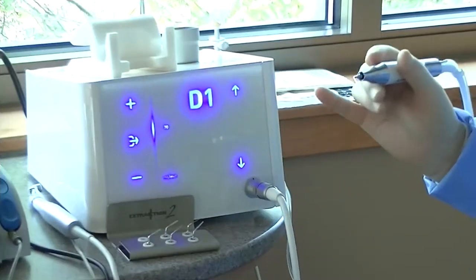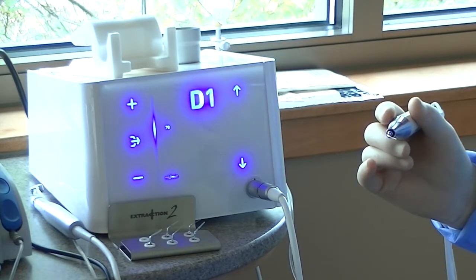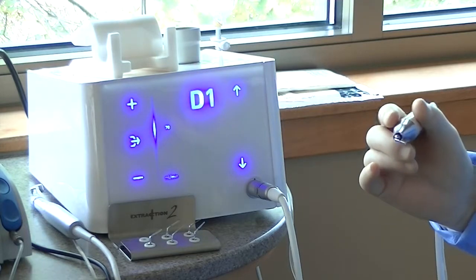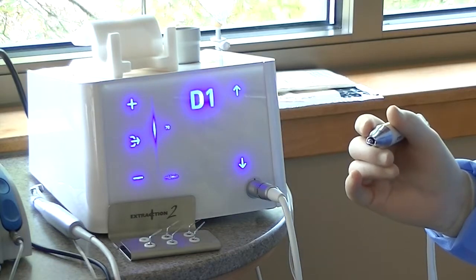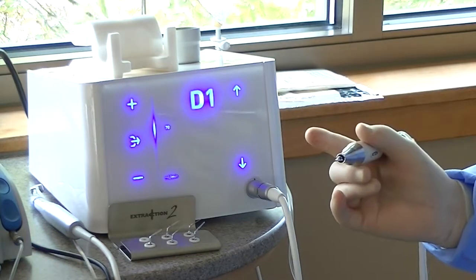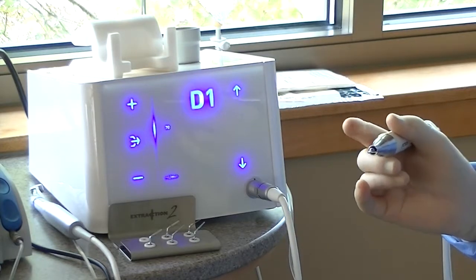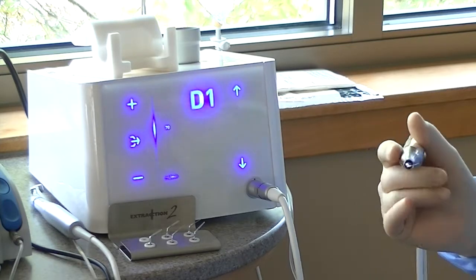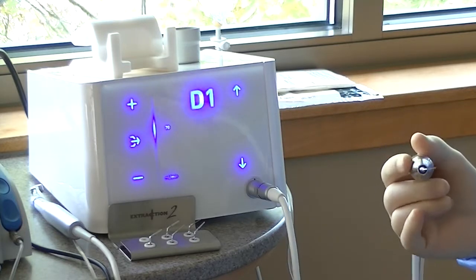So we're going to remove the tooth, and I showed you several ways of removing a tooth. We use the autotome. We use the physics forceps. We talked about conventional techniques of using a periotome, a luxator to remove a tooth, and then a forceps. Another approach that we have is a piezo, and this is called a piezo cube from Acteon. It's a really wonderful piece of equipment, and what we're going to do is use the piezo to break down the periodontal ligament and see if we can get this tooth out.